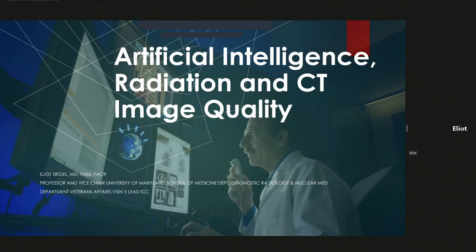Yeah, so that's a good question. And the challenge in trying to determine noise in an image is, where in an image do you measure? Do you measure in a homogeneous area, maybe over the liver or over the bladder or gallbladder, or do you measure over the lungs, which can vary? And so, one approach, which is really fascinating, is to say, well, the air outside of a patient should be fairly homogeneous. And so to be able to utilize that in being able to try and create sort of a metric for overall noise in an image. And so that was the rationale.